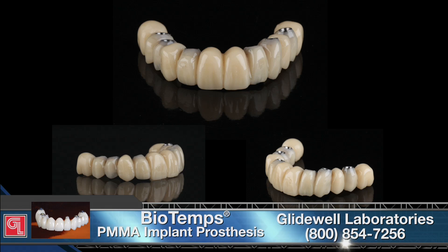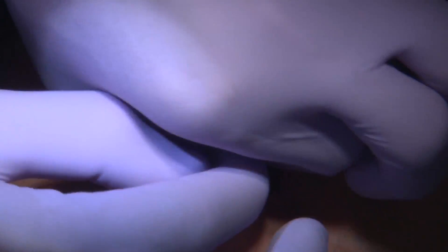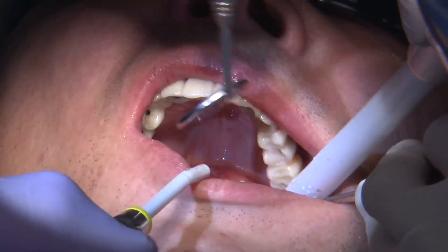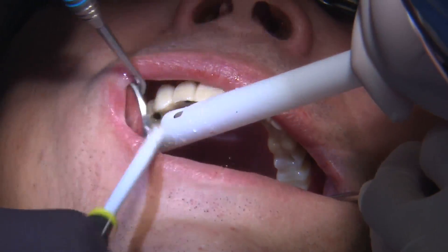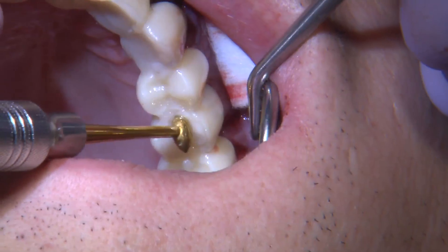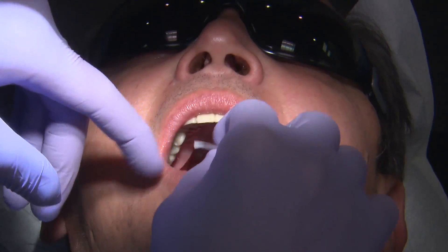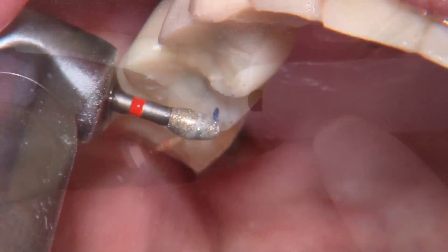I go back into the mouth and seat the full arch temporary, making sure the occlusion is balanced. Once I deliver the full arch maxillary temporary restoration, checking the occlusion takes about as long as placing the implants or picking up the temporary. The occlusion is extremely important in this situation. I place Teflon on top of the screw access holes and then packable composite. Once my assistant cures everything, I make fine adjustments to aesthetics, recheck the occlusion, polish everything, and the patient is ready to undergo a period of healing.